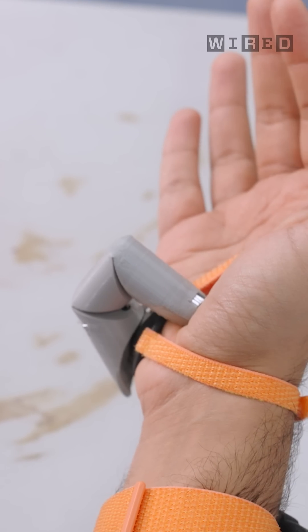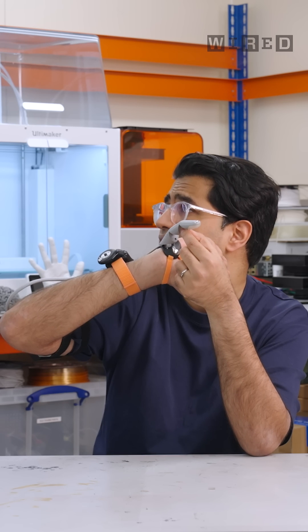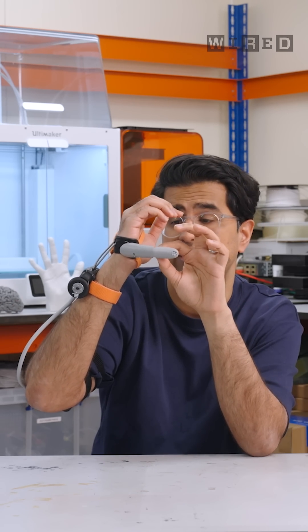It sounds like a little robot or a droid from Star Wars. You can see the 3D printed corrugation on the inside, and these tendons are super thin. What are they made of, Dani? It's kind of like a technical fishing line. So fishing line — strong, light, and pretty robust.